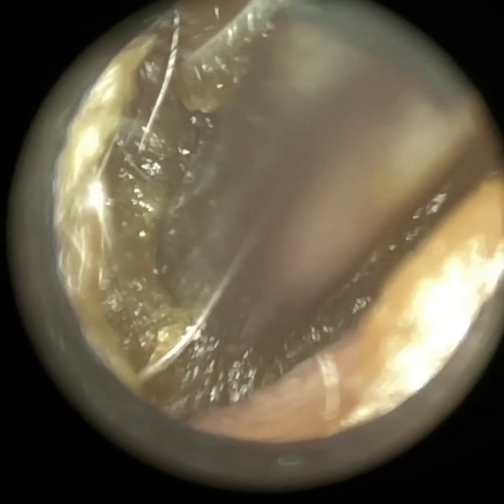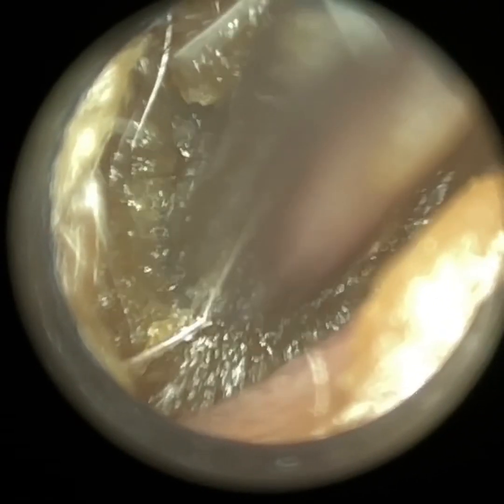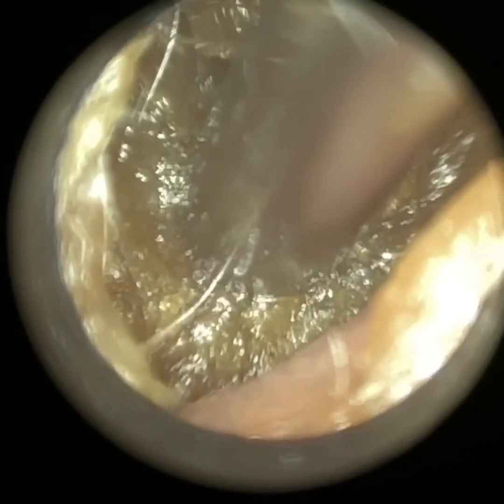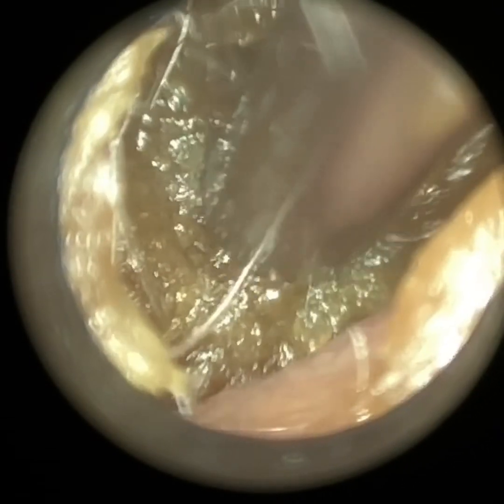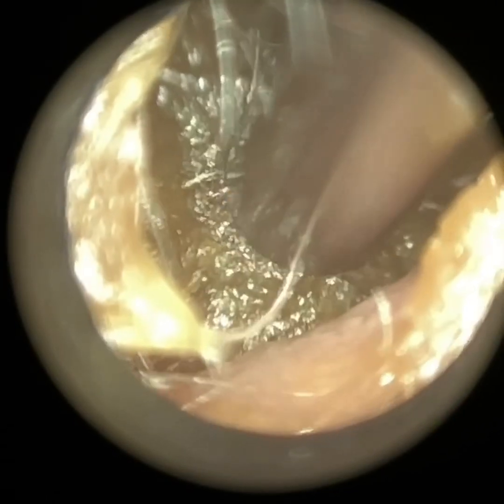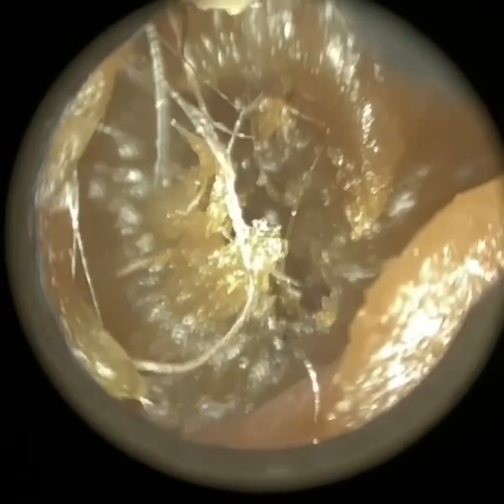I'm just working at the bottom of the ear canal here, trying to lift it up and away to separate it from the canal walls. It's a bit sticky as you can see. During the procedure it did block the suction tube on a couple of occasions — I think that was one of them just a moment ago.